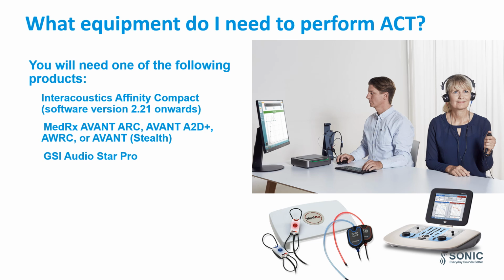For MedRx, it is available in Avant ARC, Avant A2D Plus, AWRC, or Avant Stealth. And for GSI, it is available in the AudioStar Pro. I put the picture of these equipments at the lower part of the screen.